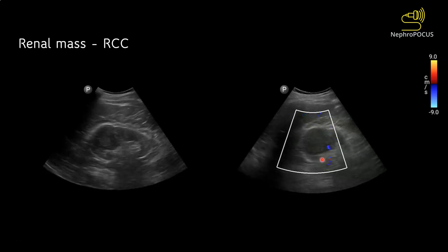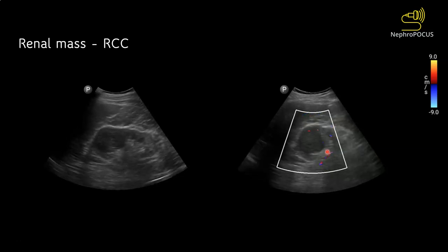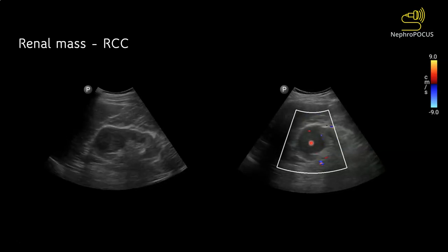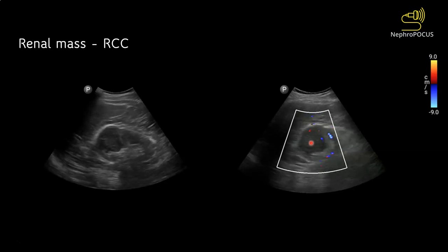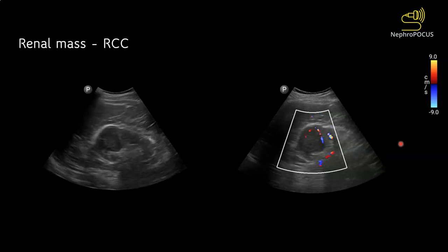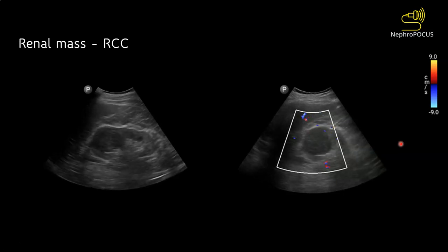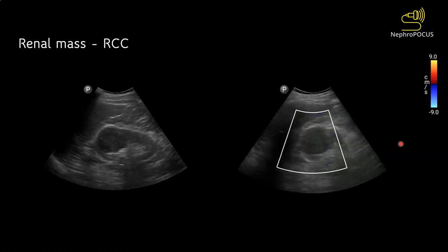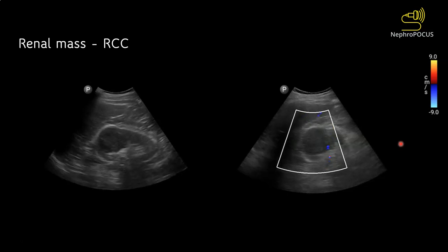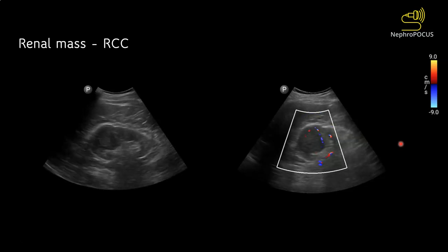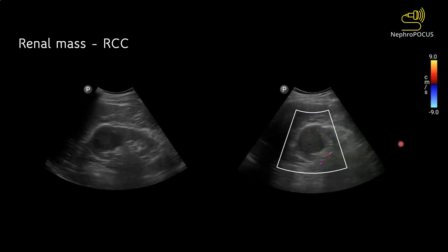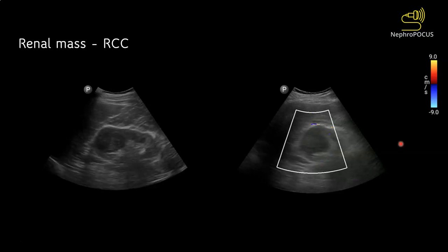In pseudo-masses, the blood flow is usually within the mass and follows a normal pattern of distribution. Though malignancy is expected to have increased blood supply, that blood supply is better detected using contrast-enhanced ultrasound rather than color Doppler.